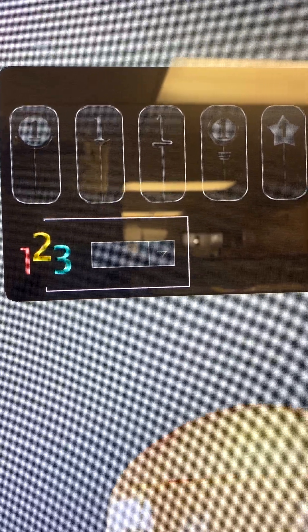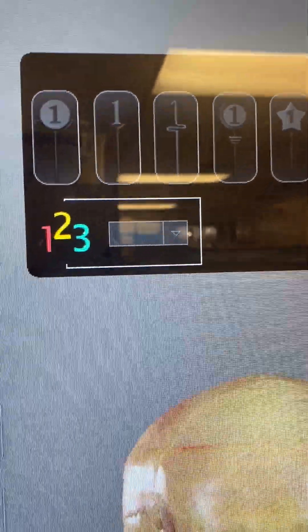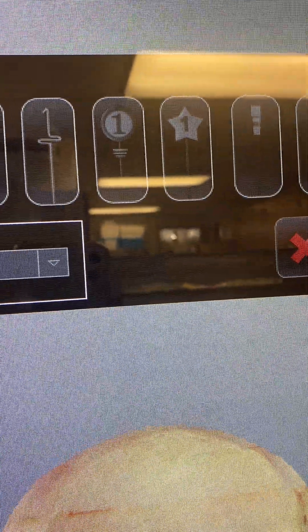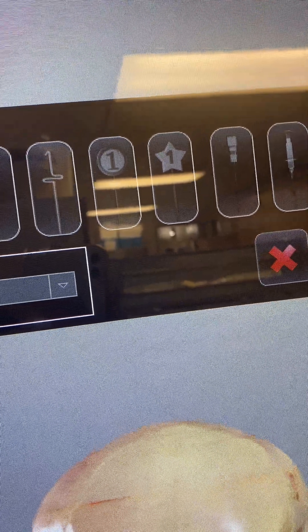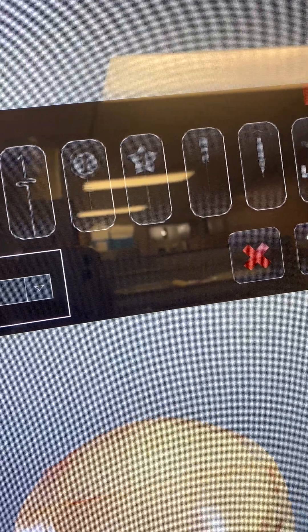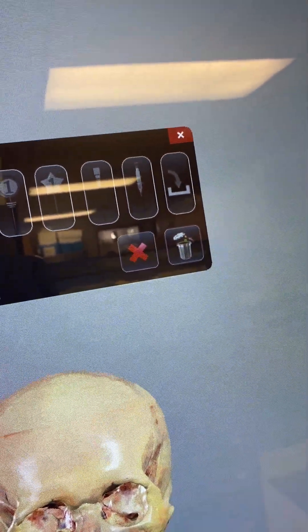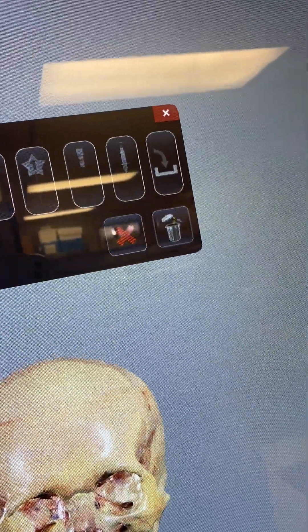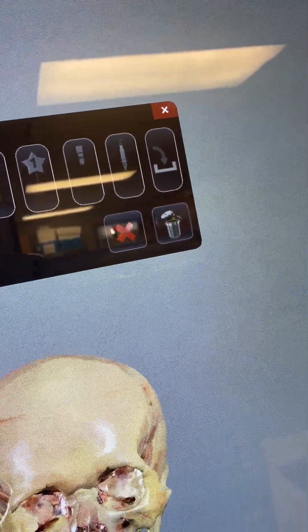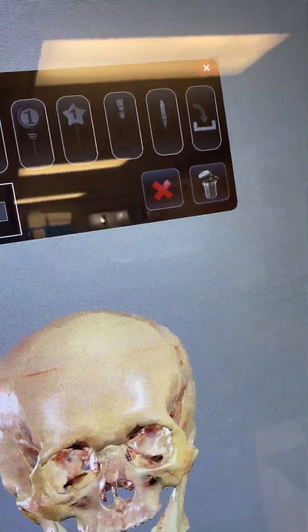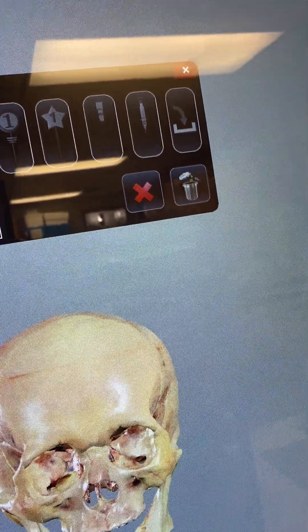Number six and number seven allow you to place a syringe or a lumbar needle. The last one is the icon for you to import a custom model into the software. For example, that's required for medical devices or implants or other things to import into the software.